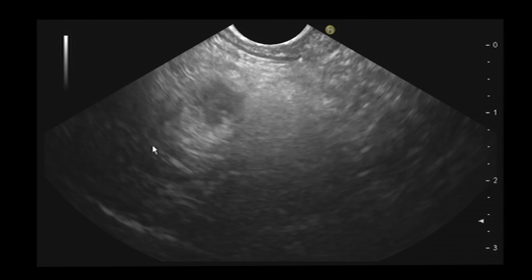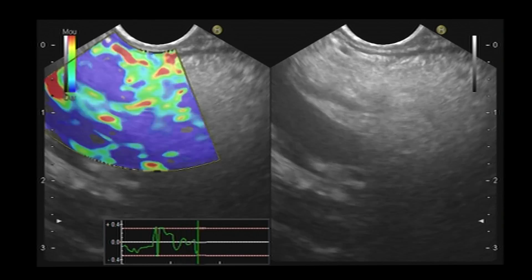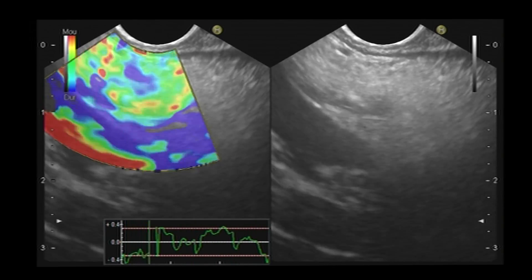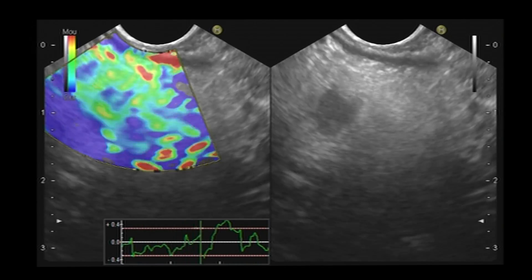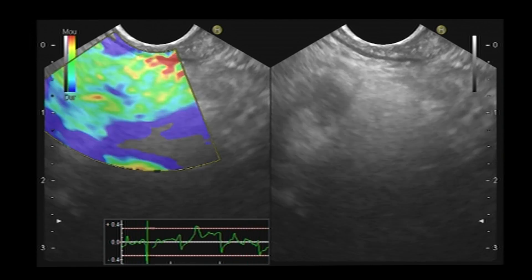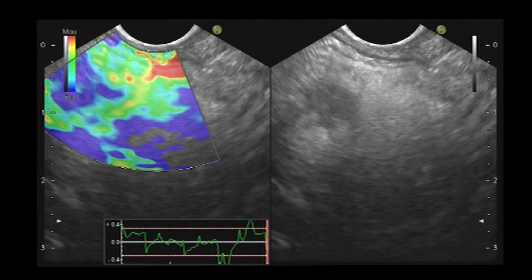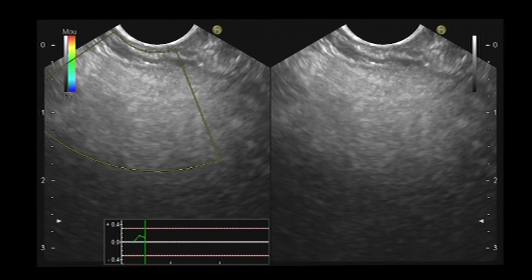Now I will use elastography to characterize the lesion. Elastography is a technique of elasticity to try to define if the lesion is hard or not. Here you see that this lesion is quite blue — a little bit harder than the pancreatic tissue.